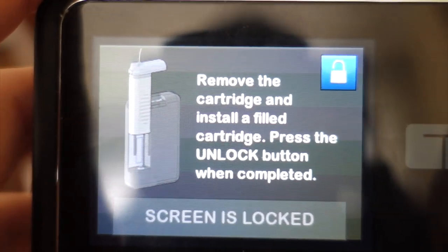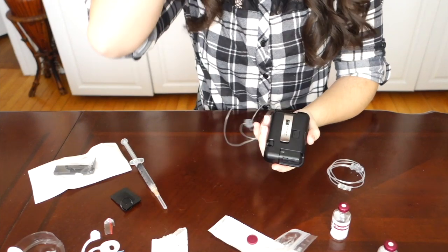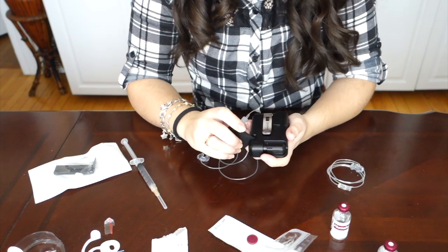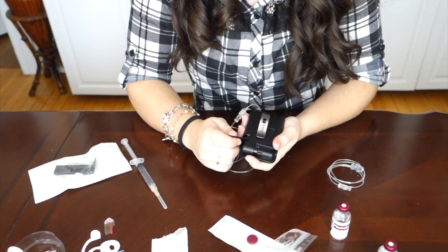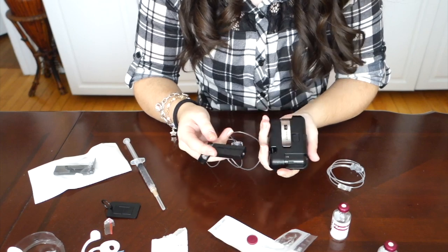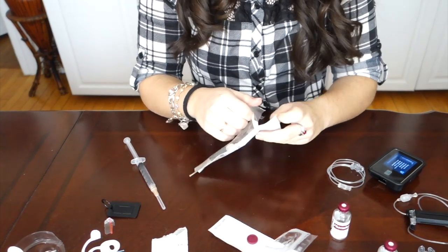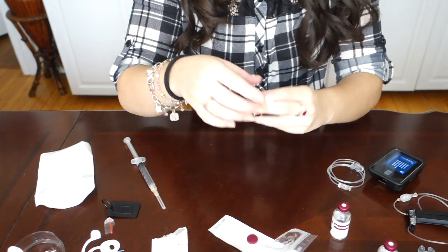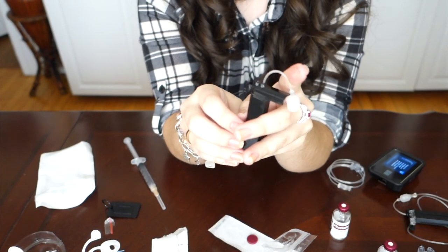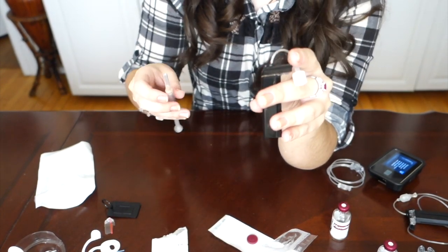The pump is now telling me to remove the cartridge and install a filled cartridge. With the case on, I don't have to take it off. I'm just going to take the little keychain that was provided to me when I received my pump and just pop it into the space and use it to pop out the old cartridge. That just makes it a lot easier to pop that old cartridge out. We're going to put that aside and take the new cartridge. This is also a step that you can actually do before you start doing anything on the pump to keep the pump from beeping at you.